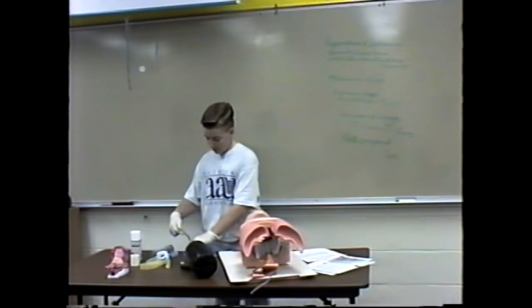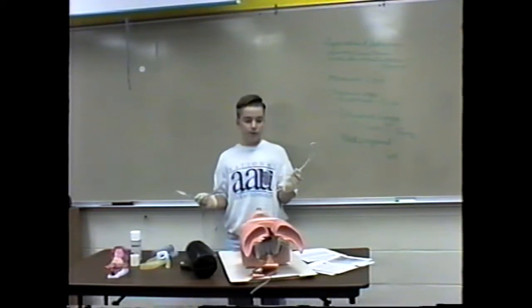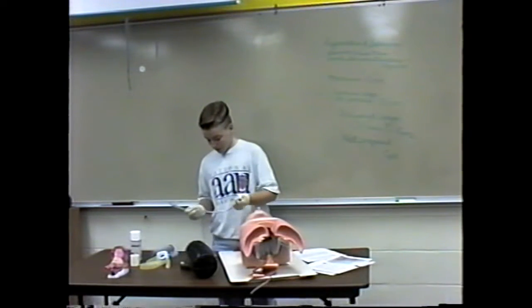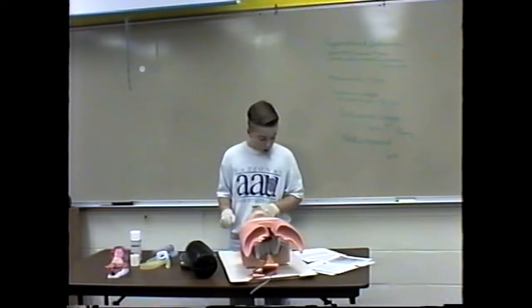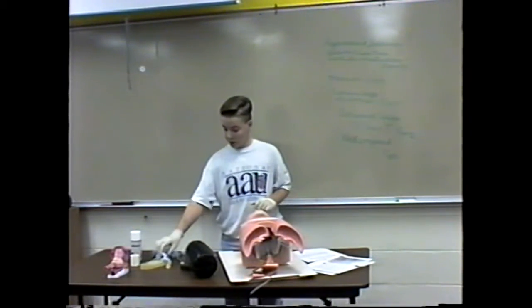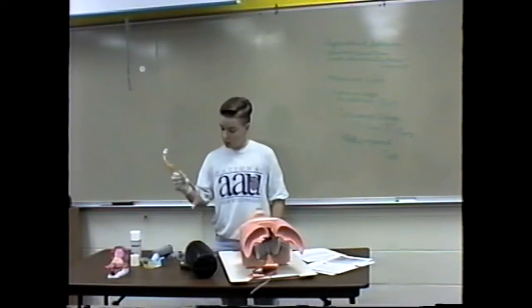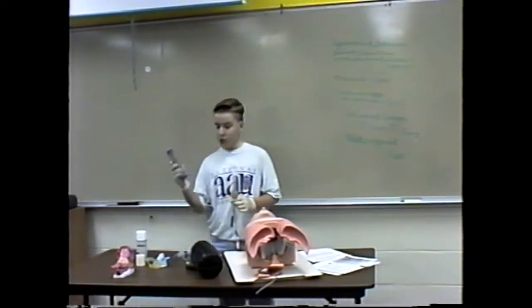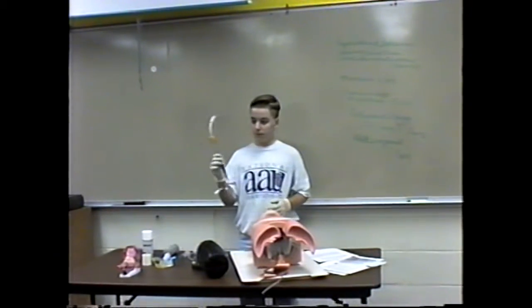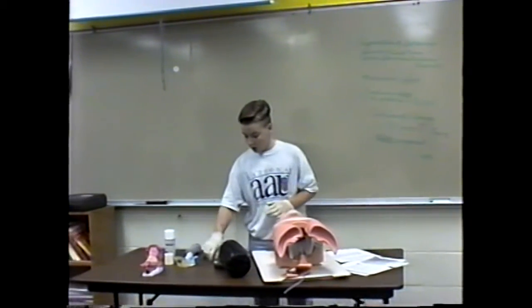An endotracheal tube with a stylet, which is just plastic covered wire. A syringe, and a commercial tube holding device, which holds the tube in place. Equipment used in the combo tube, which is this, include a syringe and the combo tube itself. A nasal intubation may include the endotracheal tube without the stylet.